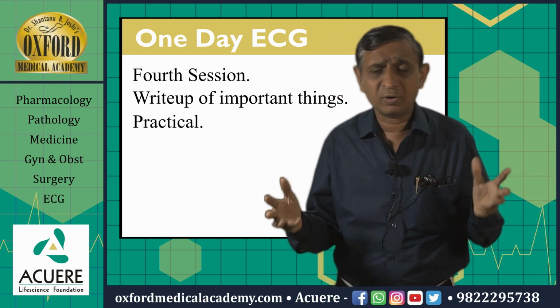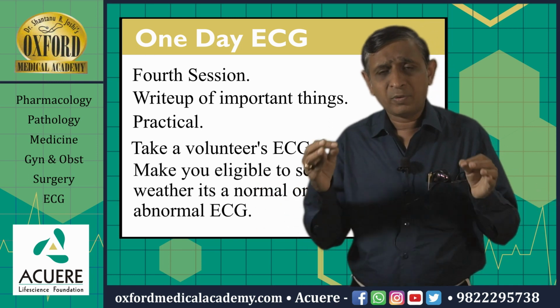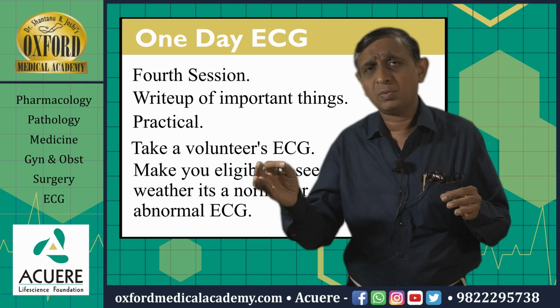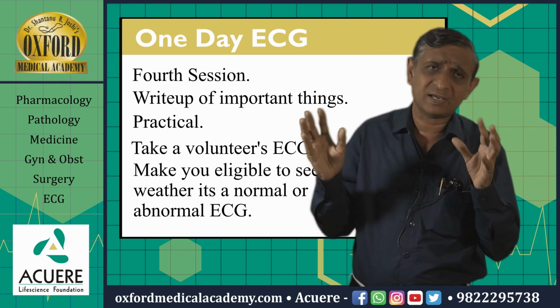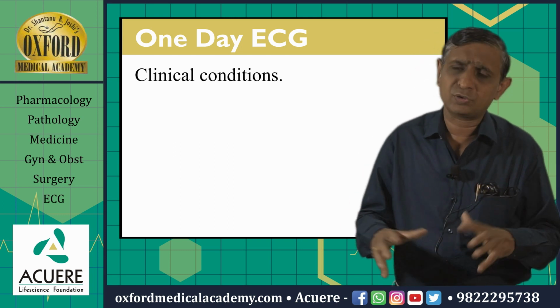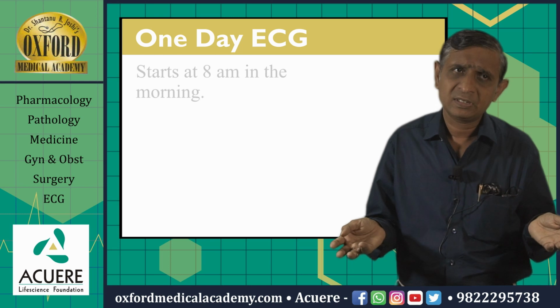So what is the practical? Practical is nothing but we take a volunteer, we make his ECG and make you eligible to see whether it is a normal ECG or an abnormal ECG. If it is abnormal, then I will tell you about the clinical condition related to it, the patterns of the ECG, and so many things we'll discuss.